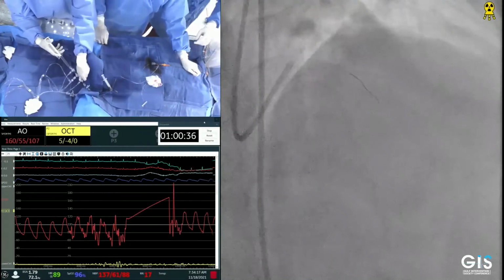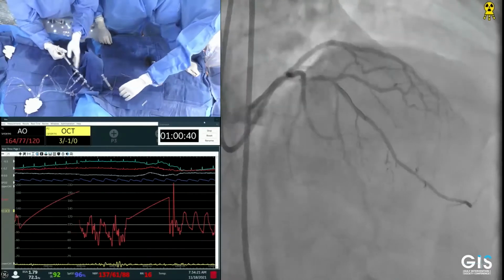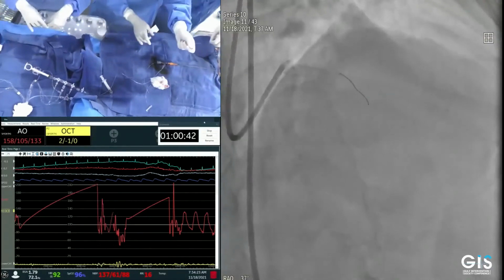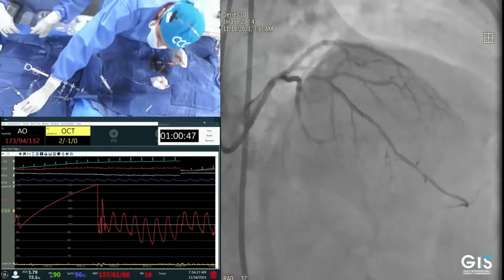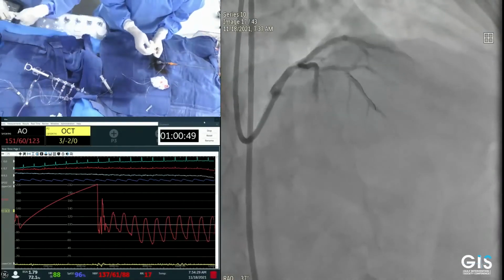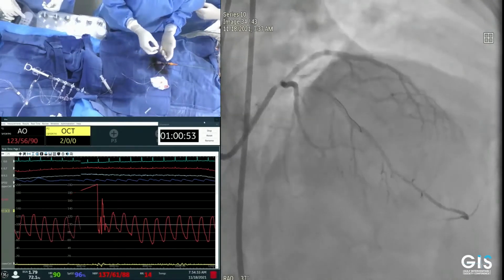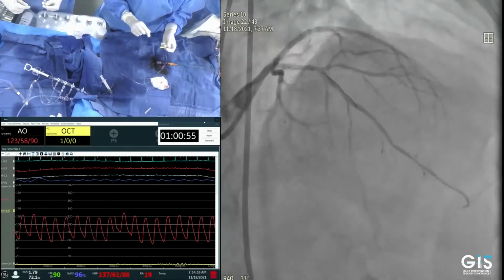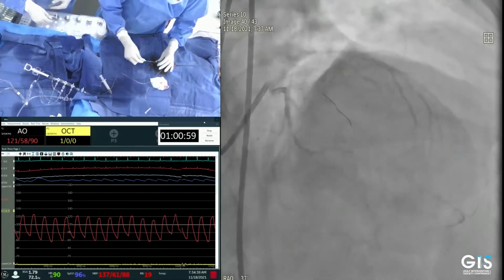For example, why not lithotripsy? Why not rotablator? So why did you choose rotablator in the beginning? Okay, I mean, various atherectomy devices are now available. We have another app called Calcificate that can help us to say which device to use for what.